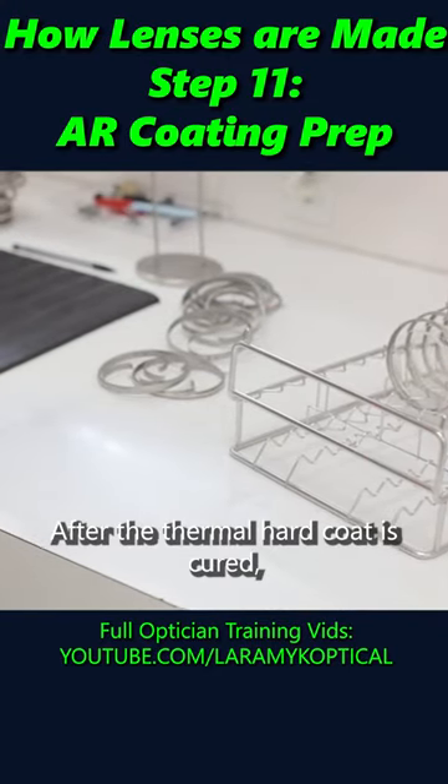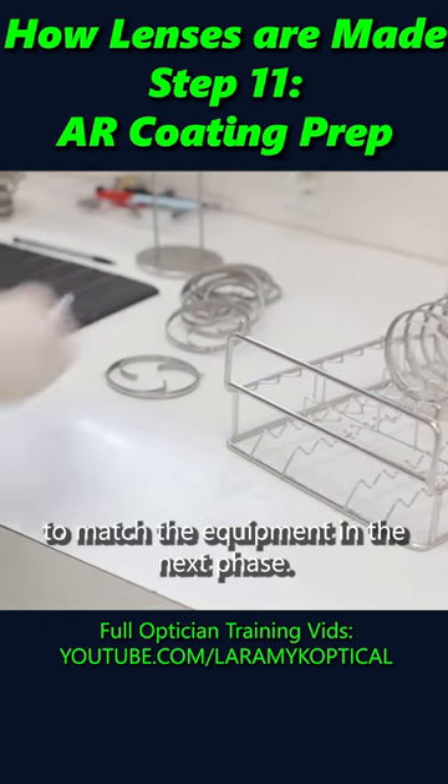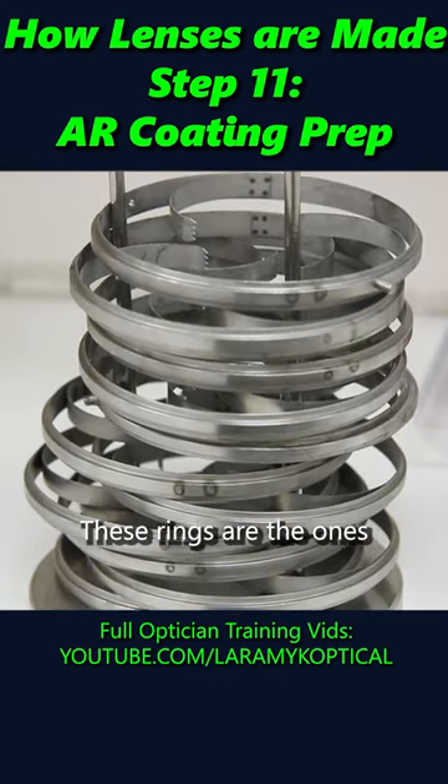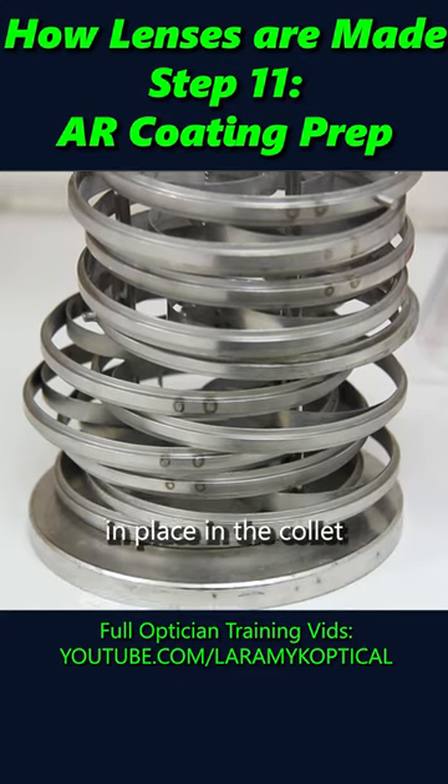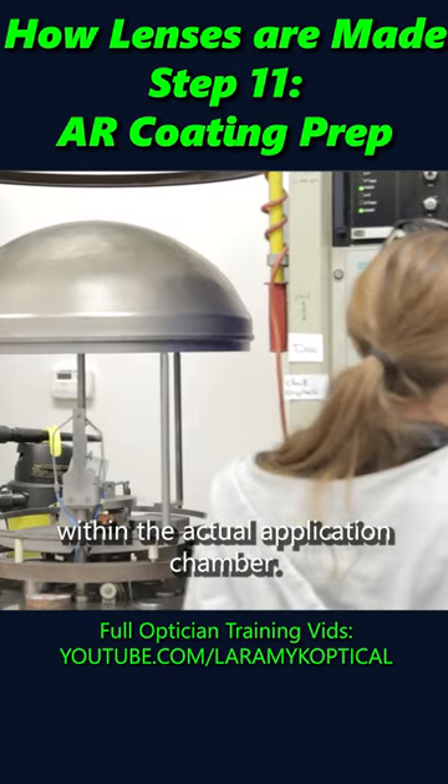After the thermal hard coat is cured, each lens must be re-ringed to match the equipment in the next phase. These rings are the ones that will hold the lens in place in the collet within the actual application chamber.